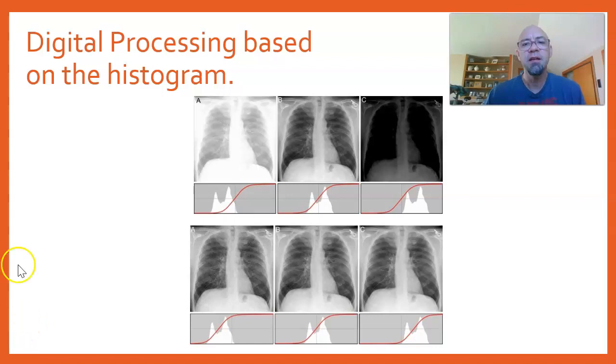Oh, I love this slide. I love this picture just as much as I love the picture of those knee x-rays that I've showed you a couple times. This is an example of how the computer will fix your image, whether you've overexposed it or underexposed it. So here we have the old logarithmic curve from film, so to speak, okay? And when you see this red line, the ideal shades of gray are going to fall in between something called the toe, which is kind of where this curve starts, and then you've got your straight line portion, and then you've got up here. So ideally, you want your shades of gray to be in here.